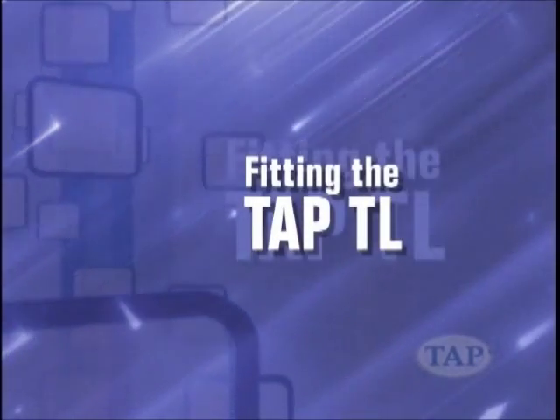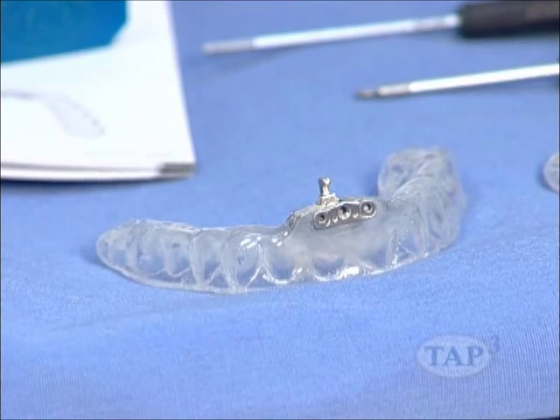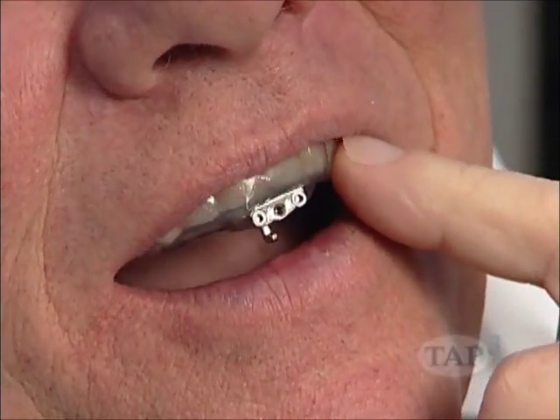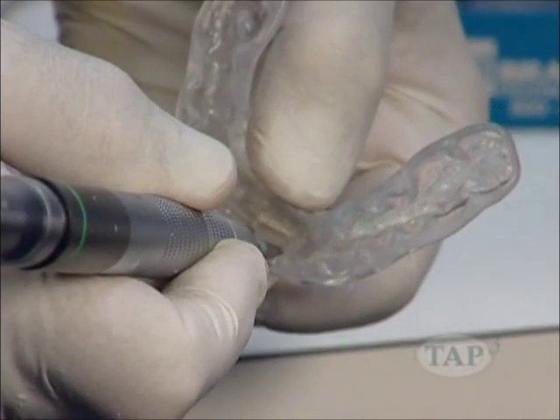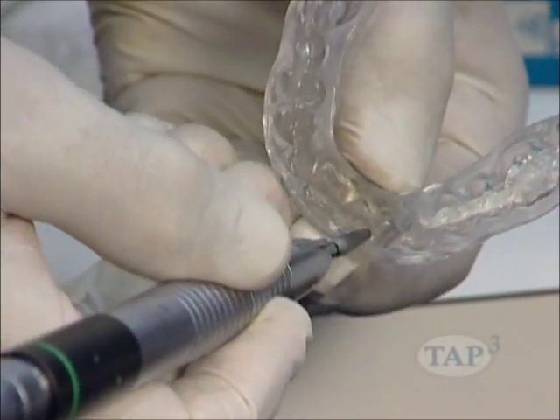Fitting the TAP TL. The following technique should be used to fit the TAP 3 triple laminate. Have the patient place the upper tray in their mouth. Check for fit, comfort, and retention. In this instance, on the upper tray, there is a particular tooth that is uncomfortable. Use a thin, straight acrylic burr. Carefully remove a small amount of the lining from the area of the tray with too much retention.